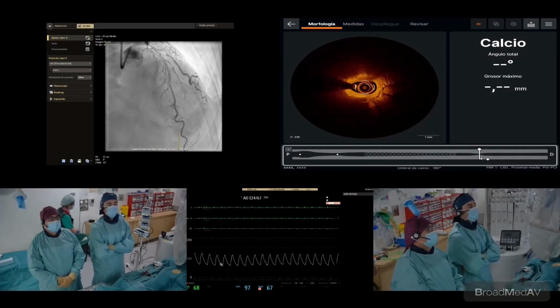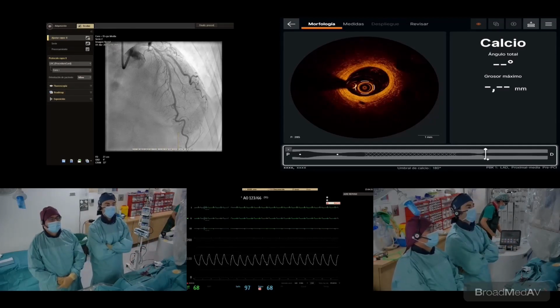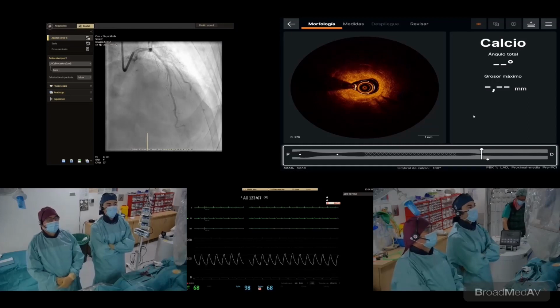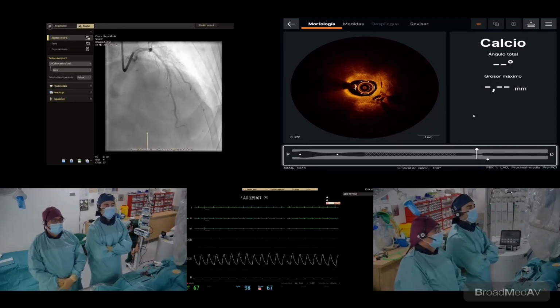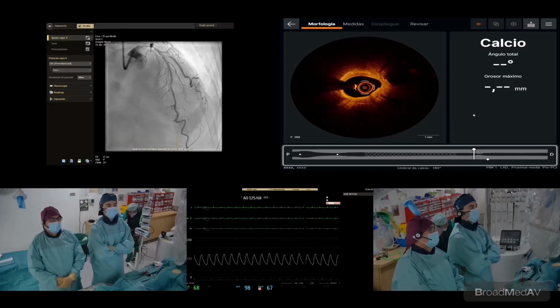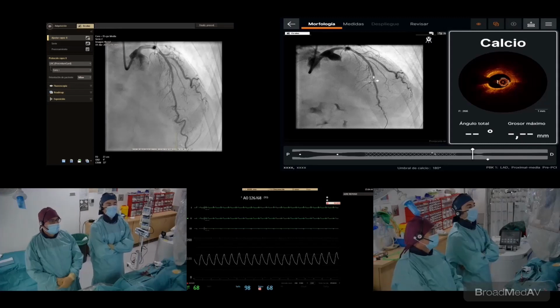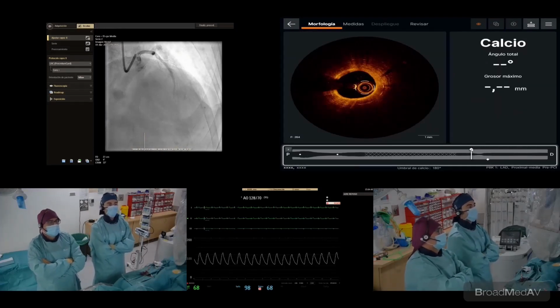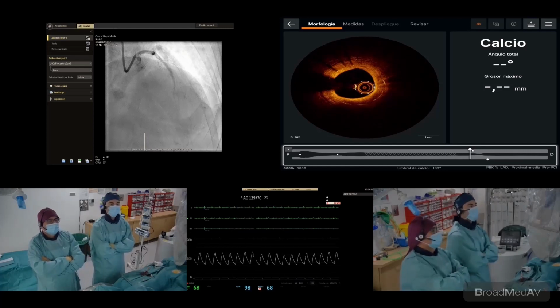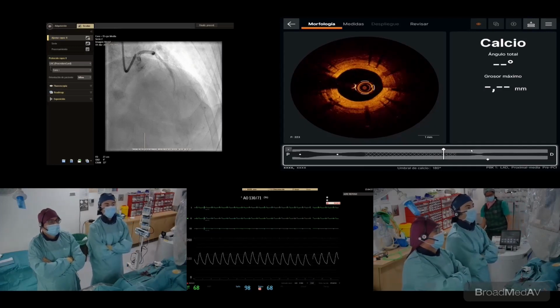So you can see from distal in this new Ultron software, the distal is in the right part of the screen, and we are going from distal to proximal. This is the distal edge of the stent. You can see severe neoatherosclerosis there, just at the edge of the previous stent. The distal reference diameter, near the measurement that Santi has done, is near 2.5, 2.3 the lumen. And inside the stent, I think it's pretty okay.